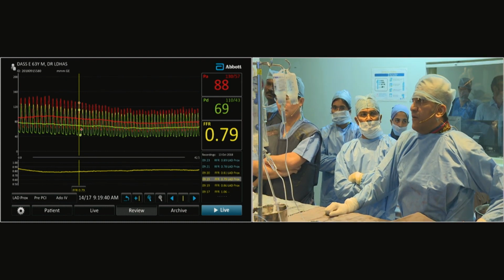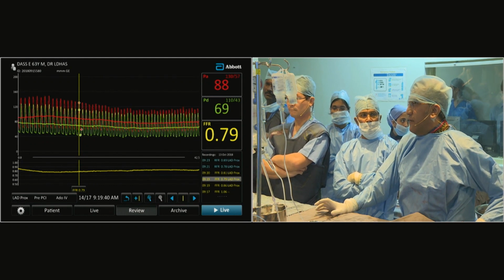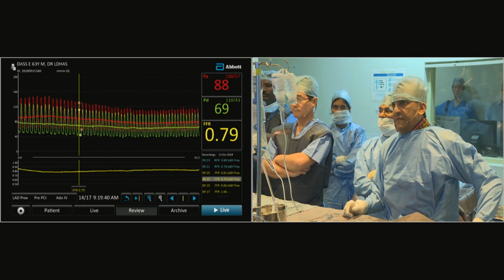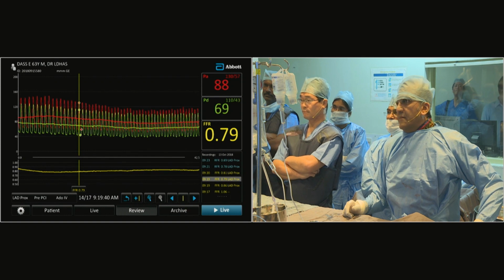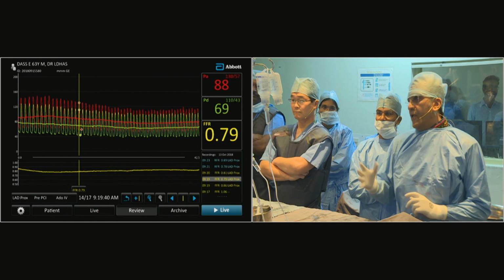Waiting to see the whole study completed, based on an FFR on a circumflex, I would not want to get into a complex angioplasty here unless the FFR was positive. So we can treat the left main LAD and come back and review the circumflex after having treated the left main LAD and see what the physiological significance is. Excellent. So let's go back to imaging.